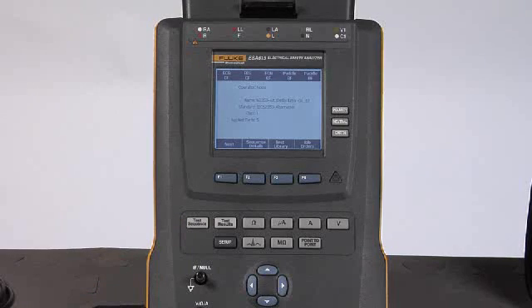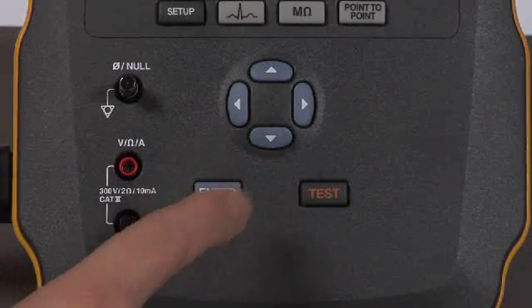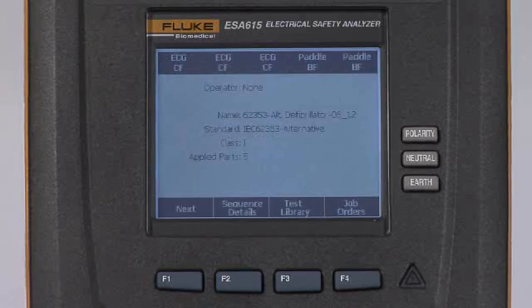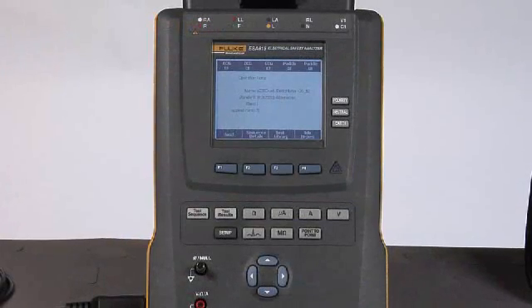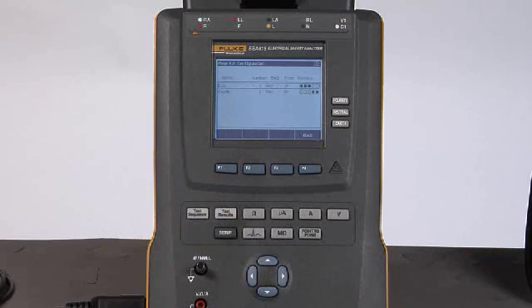If this test sequence is not the one you want to run, you can easily select one from the test library using F3, then use the navigation arrows and the enter button to select the desired test sequence. To see the details about a test sequence before running it, press F2 and use the navigation arrows to scroll through each test step to confirm settings. The view applied part button allows you to set up your applied part modules — that is, which groups of patient-applied connections should be tested together and in what particular way.